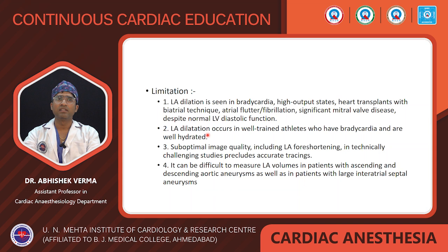Or you can say LA dilation also occurs in athletes because they have bradycardia. It means if there is LA dilation in a normal patient, it sometimes occurs, but this is normal. We do not suspect diastolic dysfunction in these patients. There is also suboptimal image quality, including LA foreshortening in technically challenging studies, which precludes accurate tracing. And it can be difficult to measure the LA volume in patients with ascending and descending aortic aneurysm as well as in patients with a large interatrial septal aneurysm.